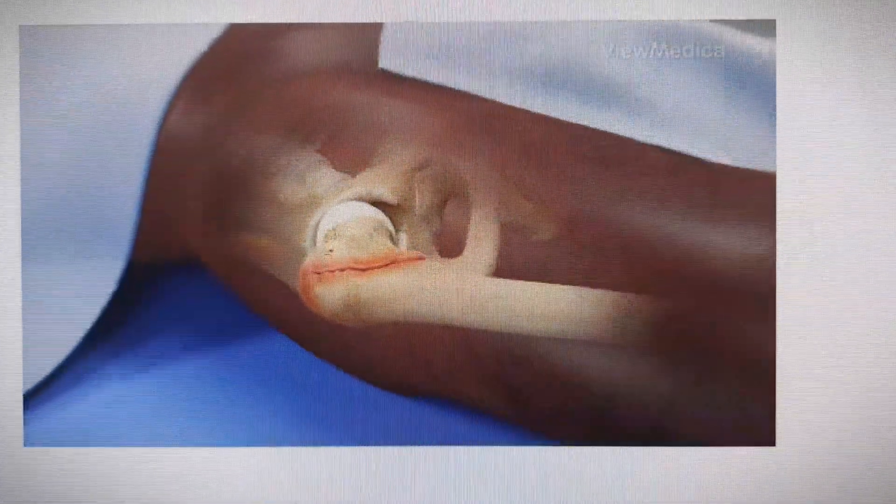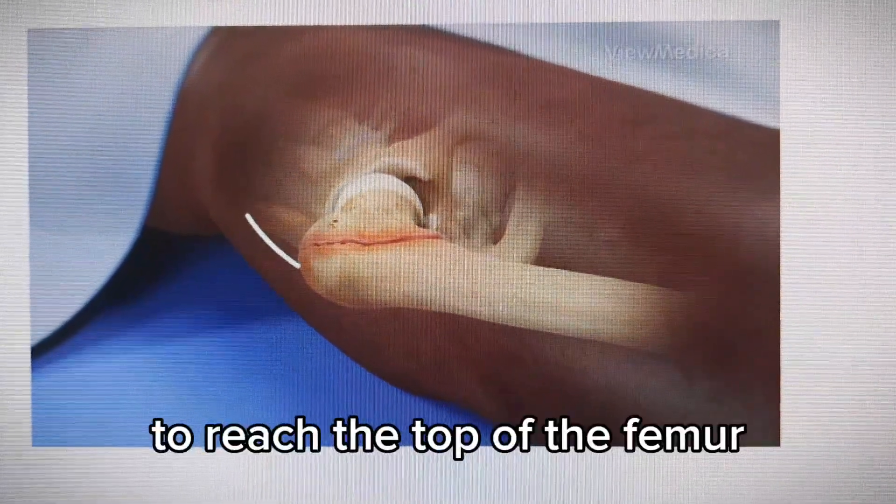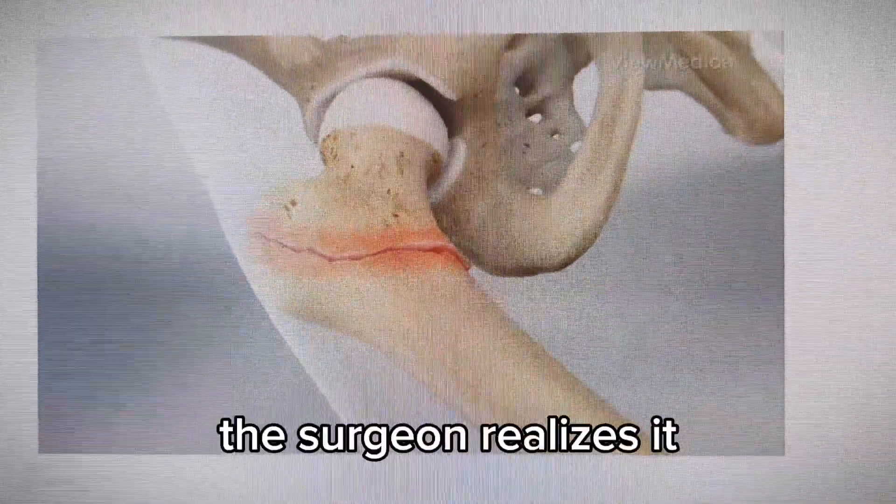To begin, you're put to sleep. An incision is made in your thigh to reach the top of the femur. If the fracture has shifted any bone out of place, the surgeon realigns it.